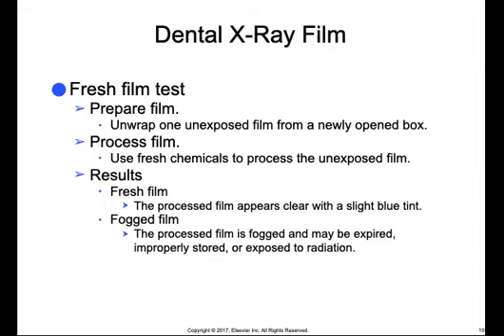If that film has expired, or has been improperly stored, or has been exposed to radiation, it might appear fogged. And if the film is fogged, it should not be used. That whole box is probably done, and we should probably use a new box.